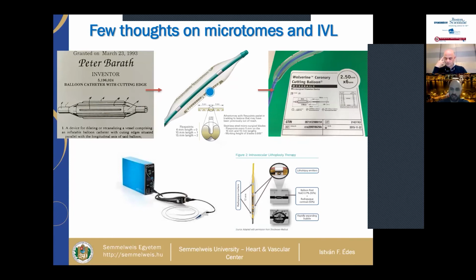It has to be mentioned very, very strictly that this is only for calcific lesions. Fibrotic lesions do not benefit at all from IVL. And IVL is only indicated in stable patients in elective cases. Acute coronary syndrome, especially with cardiogenic shock, presents a strong contraindication to IVL therapy.